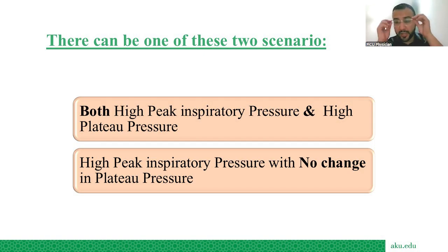Scenario number one, both peak inspiratory pressure (P peak) and P plat are high. Scenario number two, peak pressure is high, but plateau pressure is the same.